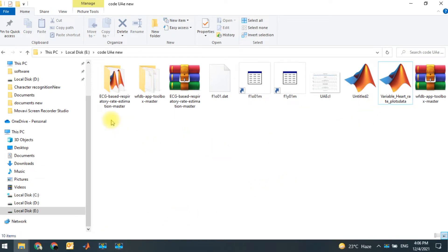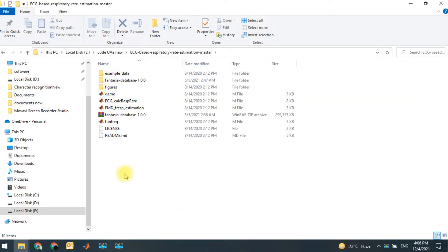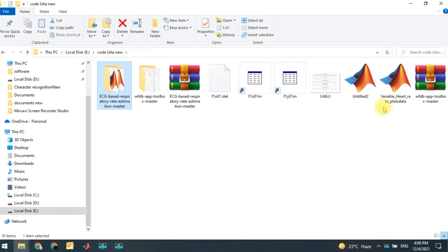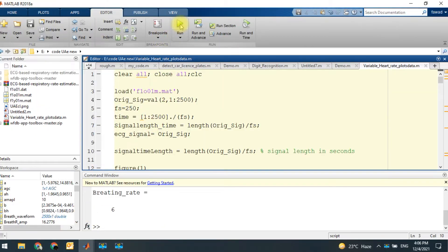This is a code for heart rate variability measurement for cardiac patients. I'm going to run the code and you will see the result.